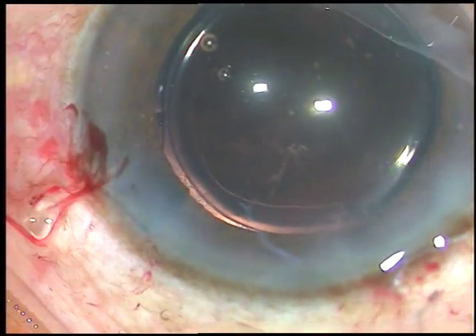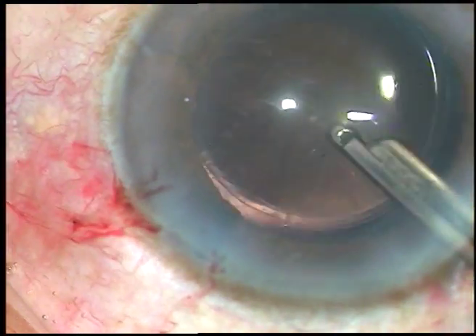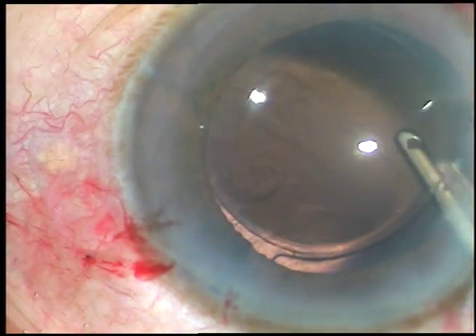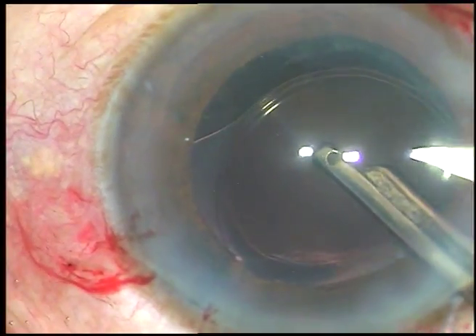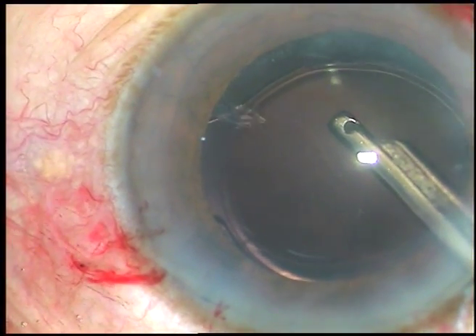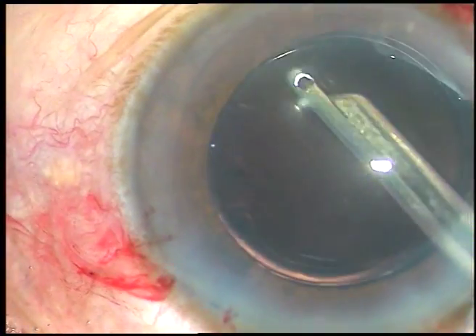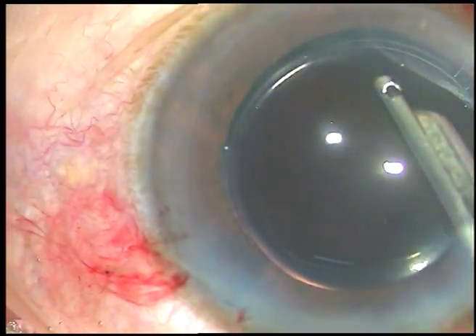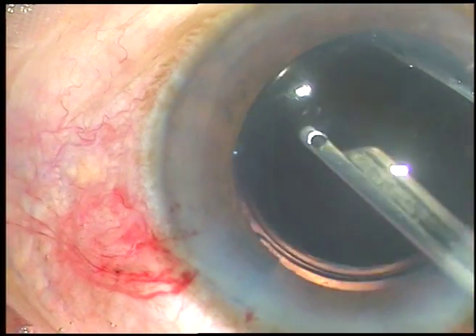Now see how to clean the viscoelastic substance thoroughly. First irrigate with Simco — irrigate the anterior chamber, irrigate the capsular bag. After thorough irrigation, aspirate for some time. A lot of visco has come out. There is some amount of cortex at 5 o'clock — this is being removed now. Some more fibres are showing up and those are also removed.